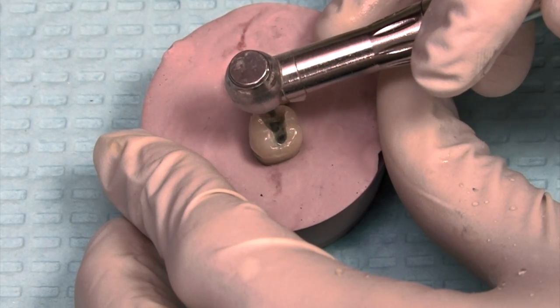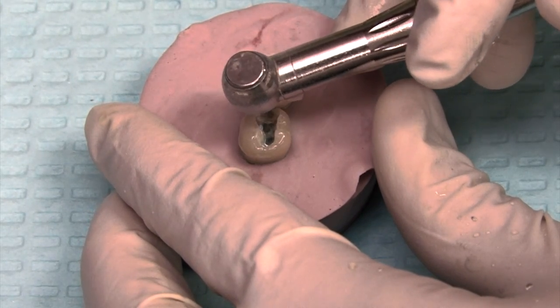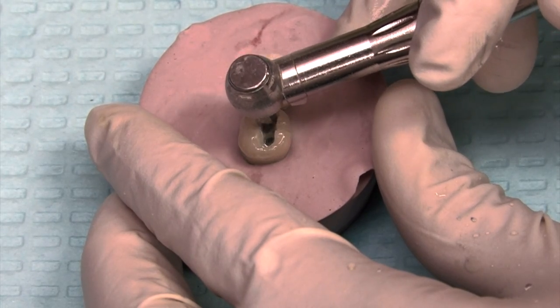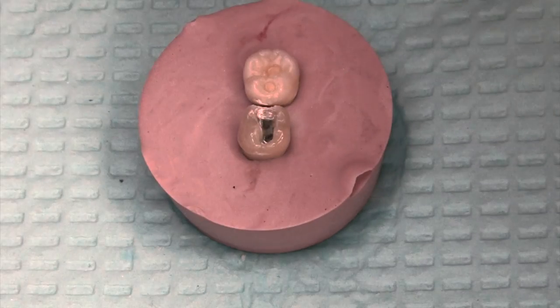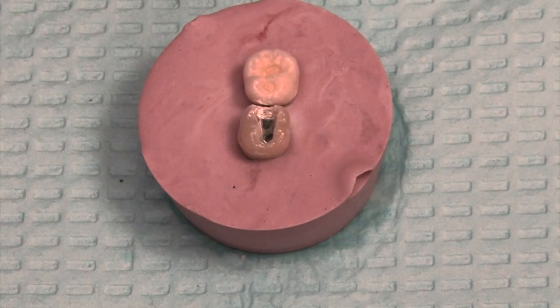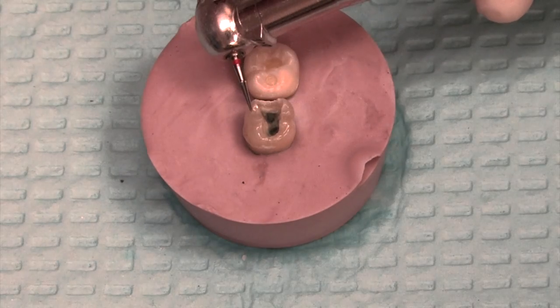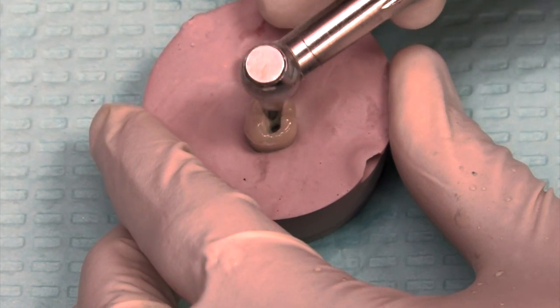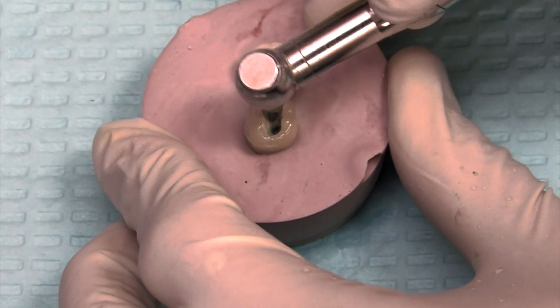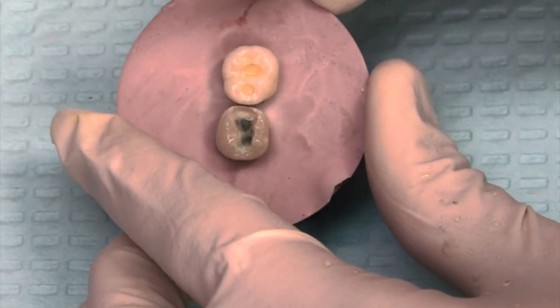Just brushing back and forth, being careful not to scuff the neighboring tooth. If that does happen, no big deal — we can go in with a fluted finishing burr and smooth up that wall. You've got to have a smooth wall in order to place a good interproximal contact. Now I'm moving on to that third burr, the fluted carbide finishing burr. The edges look a little rough right now, but I'm going to take this burr and smooth up the interproximal wall — the buccal, lingual, and gingival part of that floor. Composite likes to go into smooth areas as opposed to rough, jagged areas of enamel.